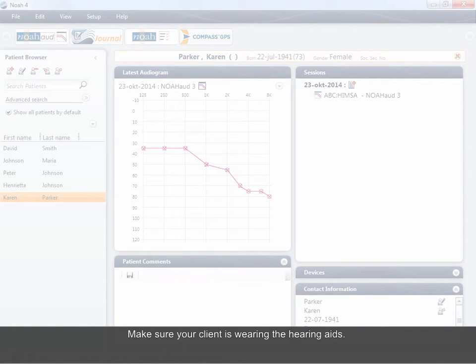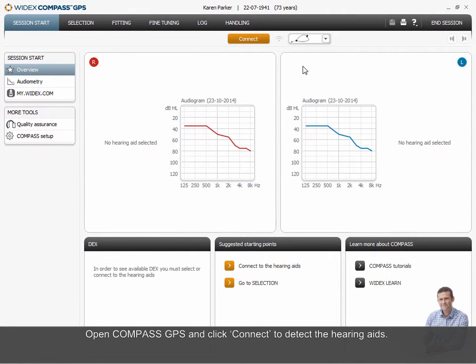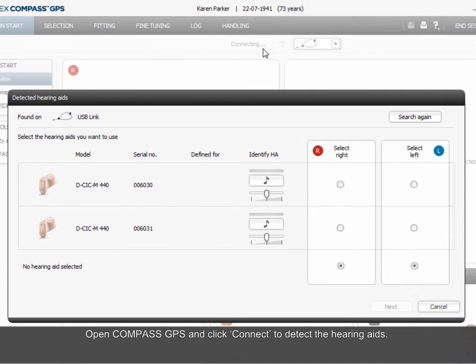Make sure your client is wearing the hearing aids. Open Compass GPS and click Connect to detect the hearing aids. Select the right and the left hearing aid and click Next.